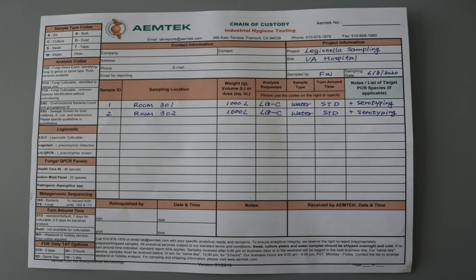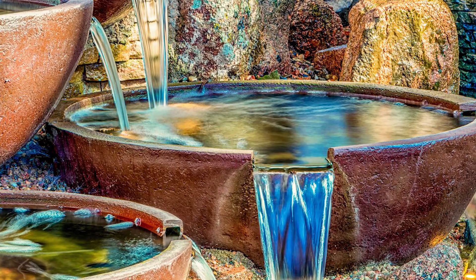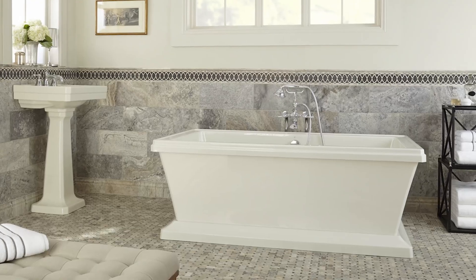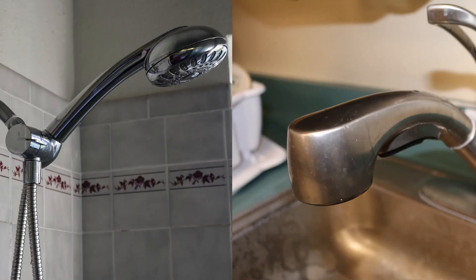Some locations to consider while sampling Legionella biofilm include showers, faucets, decorative fountains, tubs, and humidifiers. We recommend showers and faucets as starting points. We'll now demonstrate how to take biofilm swab samples.